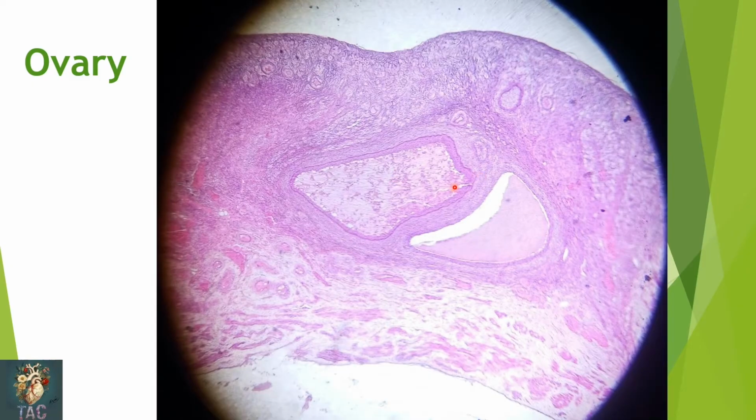So another diagram through the follicle, in which you can see this large follicle, maybe the Graafian follicle, but in the section you can't see the oocyte, which is not present in the section. In the center you can see the antral fluid, and surrounding the antral fluid are the granulosa cells, and then the theca cells. So these two may be Graafian follicles, whose oocyte is not taken into this section, and in the center you can see the antral cavity with the antral fluid.